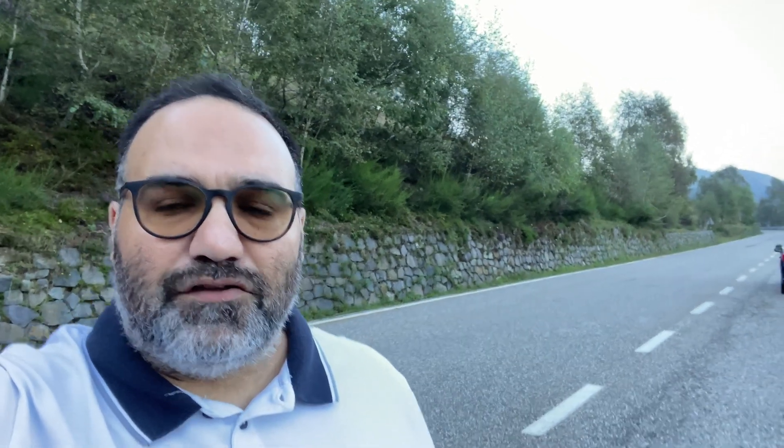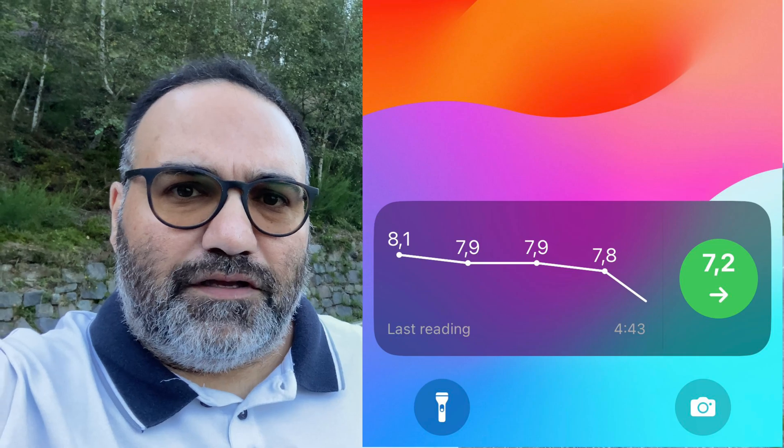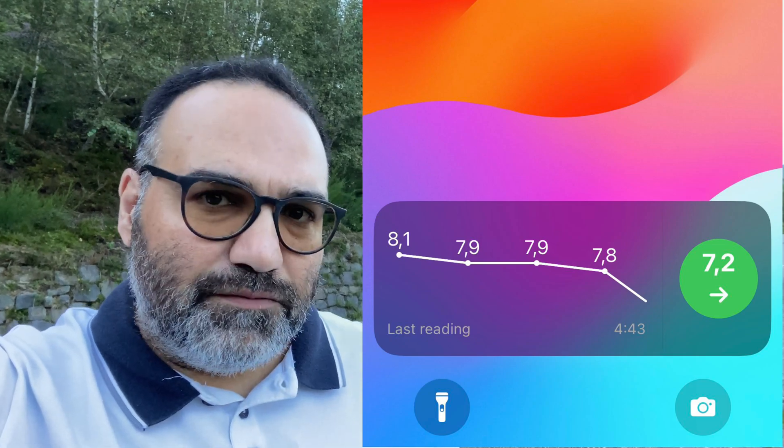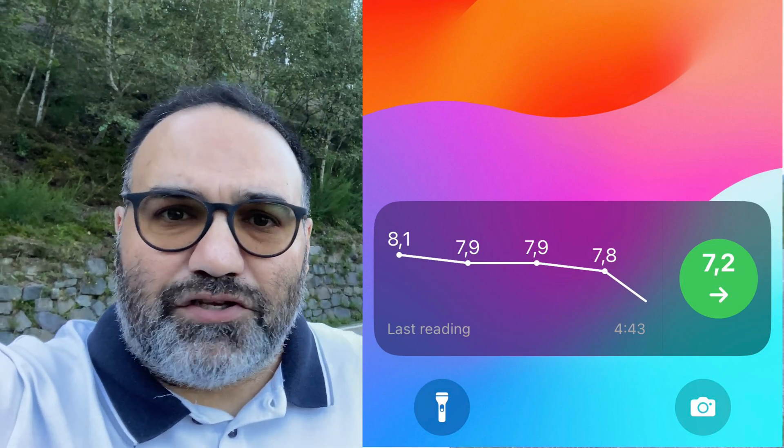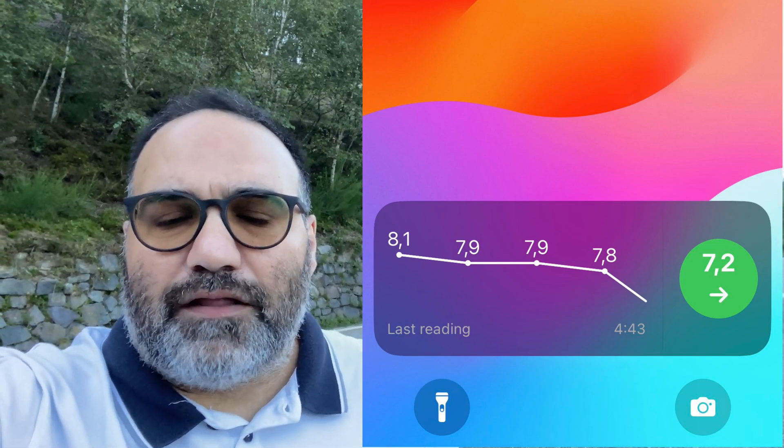It's now about six months after I started using my iPhone with the Freestyle Libre 3, and I have been looking for an app where I can see the live activity on my lock screen, but haven't managed to find one. In fact, I gave up.